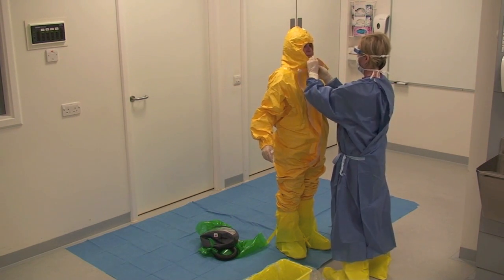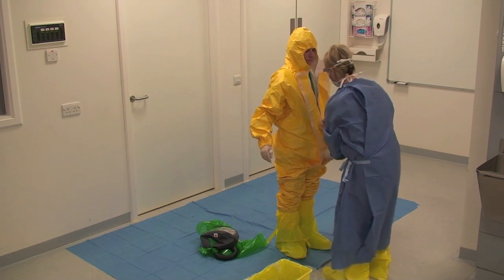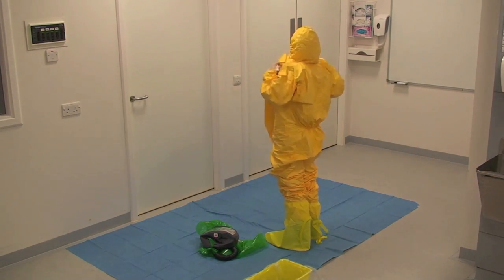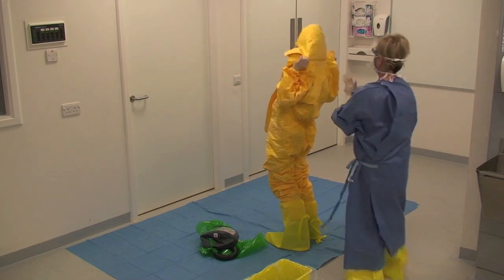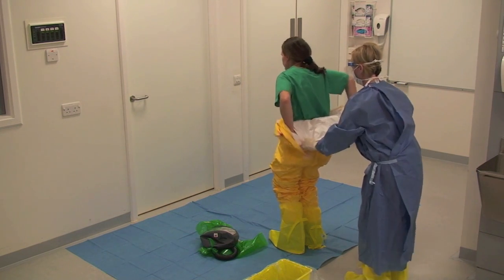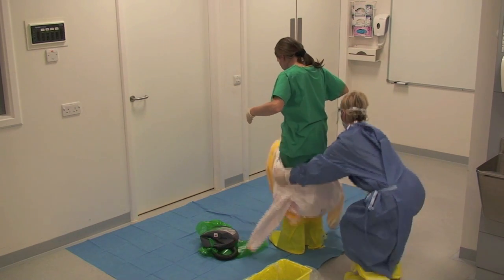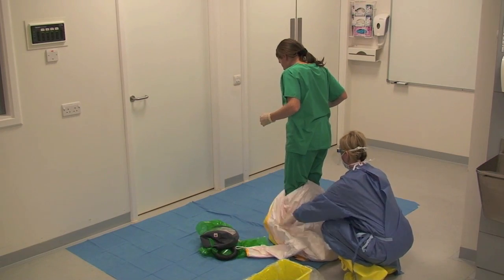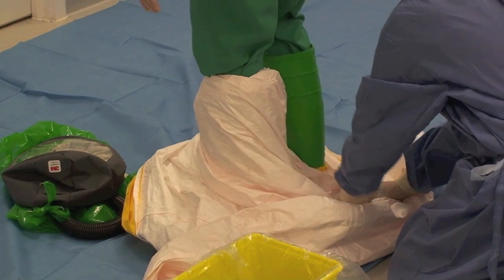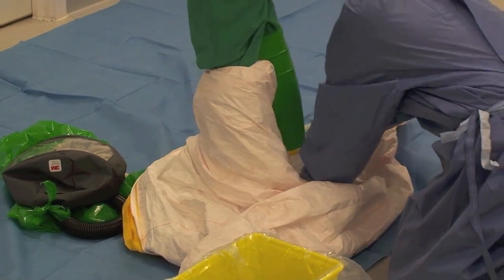The buddy assists the healthcare worker to remove the coverall. The buddy then removes the coverall by rolling it backwards, taking care not to touch the exterior of the healthcare worker's suit. The buddy assists the healthcare worker to remove their feet from the coverall, then the healthcare worker stands on top of the coverall.